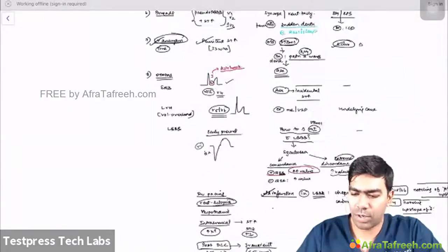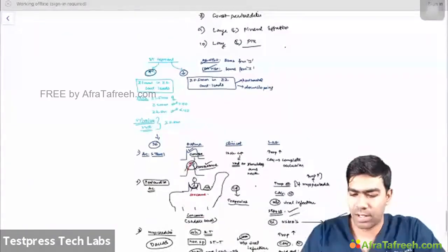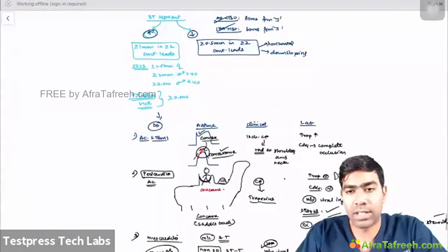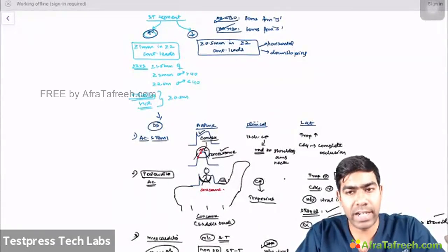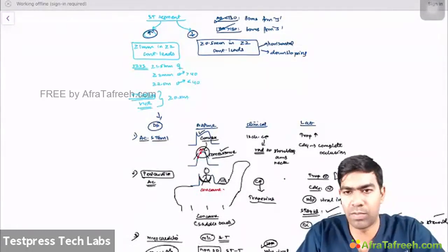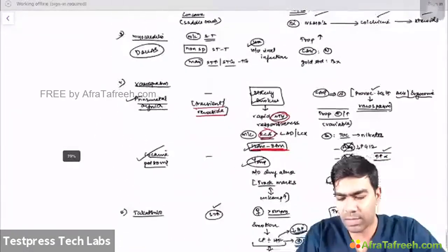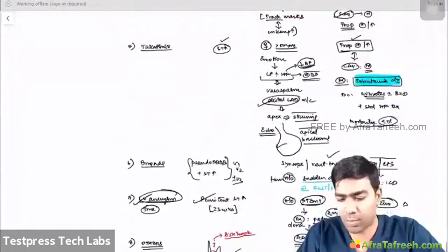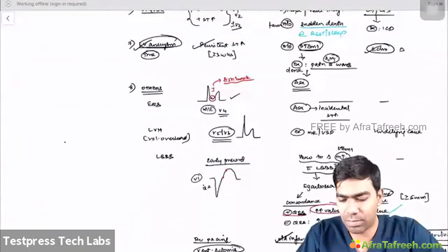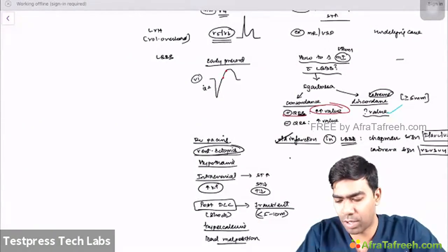The most important causes I've explained in detail, step by step, in the entire ST elevation topic. I've given a lot of clinical ideas also, which will be very useful for your exams, especially when answering clinical questions. That's why I told you in a table form so that you can revise easily later on. So acute STEMI, how it will behave, pericarditis, myocarditis, vasospastic conditions, Takotsubo cardiomyopathy, Brugada, aneurysm, then early repolarization, LVH, LBBB, including the Sgarbossa criteria, all these things are important.